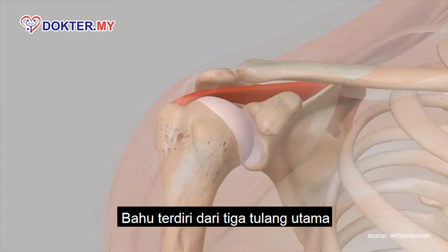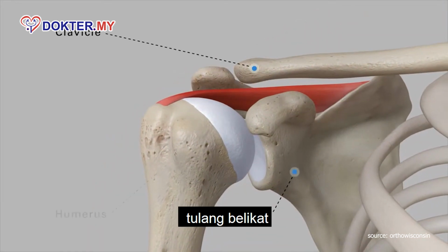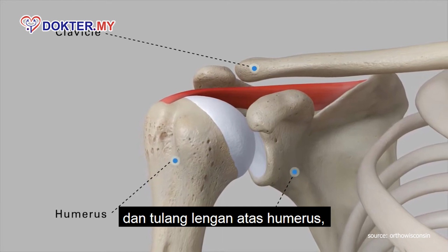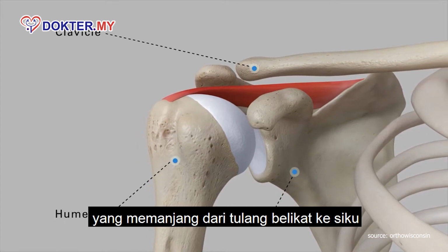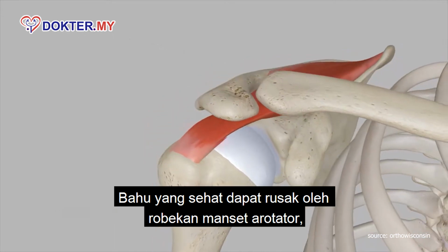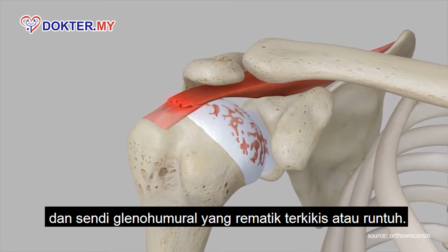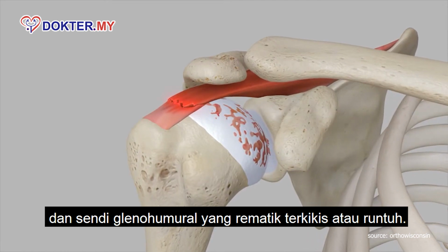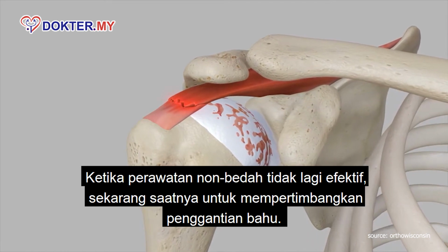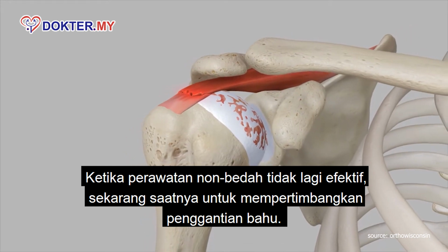The shoulder is comprised of three main bones: the collarbone, clavicle, the shoulder blade, scapula, and the upper arm bone, humerus, which extends from the shoulder blade to the elbow. A healthy shoulder can be damaged by a rotator cuff tear, a superiorly migrated humeral head, and an arthritic eroded or collapsed glenohumeral joint. When non-surgical treatments are no longer effective, it is time to consider shoulder replacement.